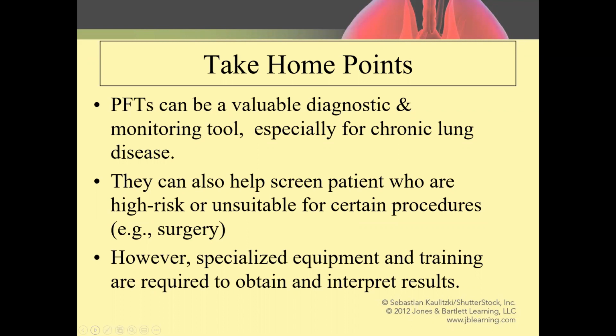However, it's important to keep in mind that specialized equipment and training is required to obtain and interpret the results. So, like a lot of things, the devil's in the details. You need the equipment and the individuals who know how to use the equipment, which is functioning properly, and also know how to coach the patients so that we can optimize the results that we're getting.